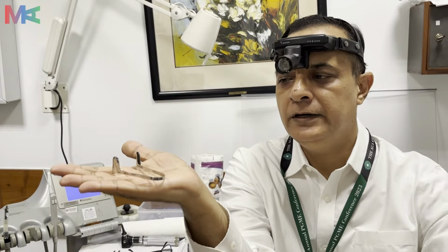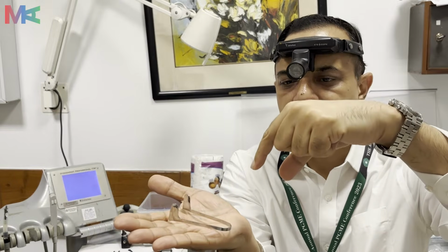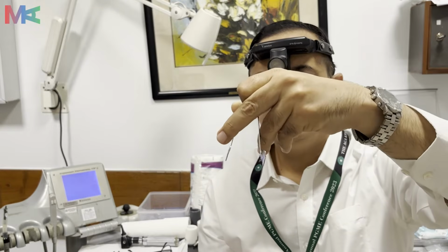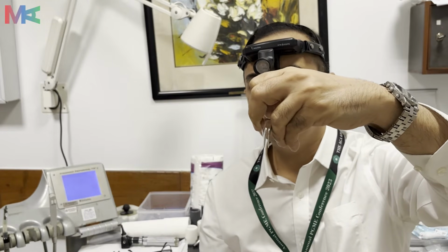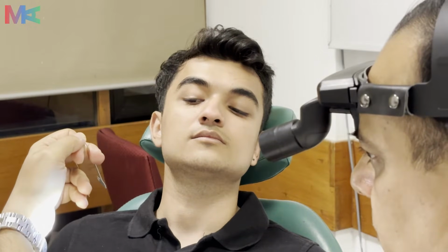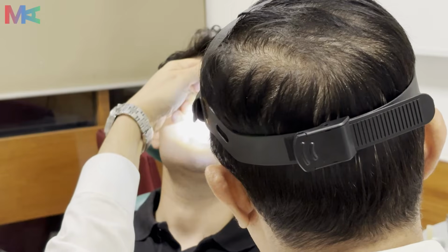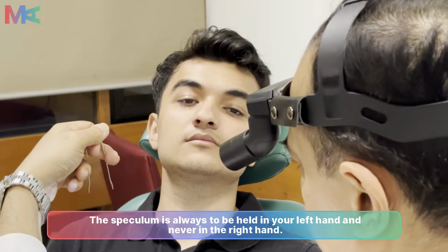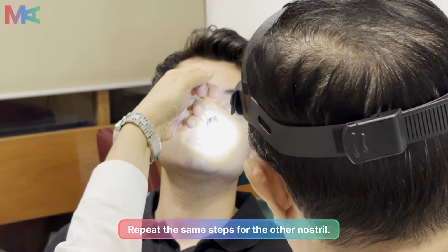So in order to hold it, you should be using left hand always and hold it with index finger and thumb like this. Pick it up and then use your middle finger and fourth finger, ring finger, to close it and open it smoothly. And we'll hold it as it was explained previously and introduce gently into the nasal cavity like this. So speculum is always held in left hand and never in right hand. Similarly, the left side of the nose.